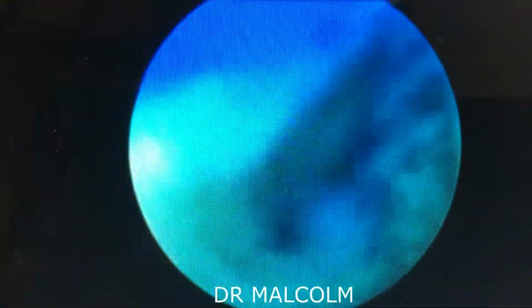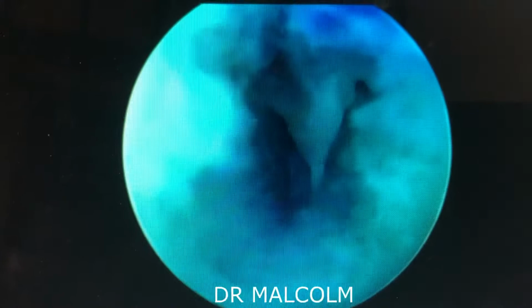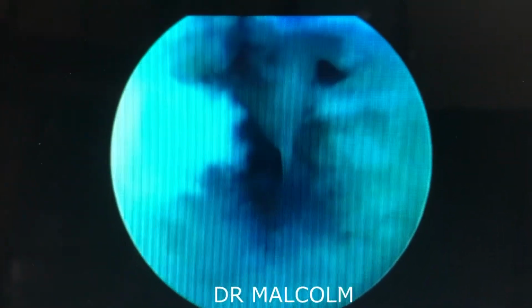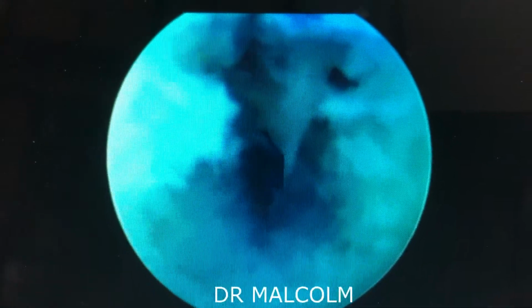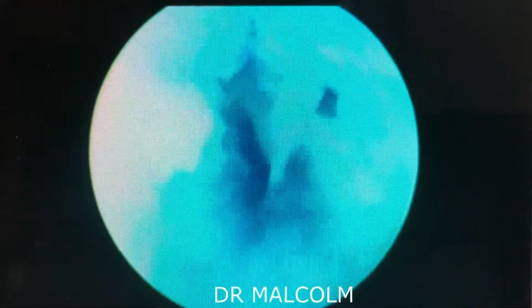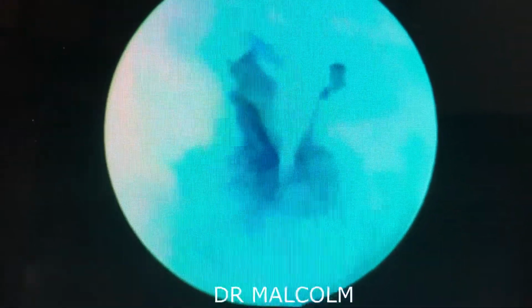One must, however, make sure one is removing enough nuclear material from within the rent and the pocket around the rent. I'm increasing the light shadow now to see deeper into the tissues, knowing very well that I have to go much more.